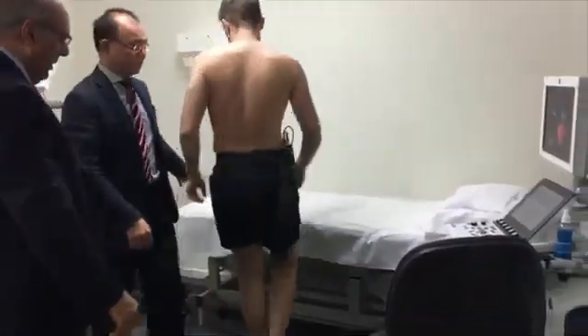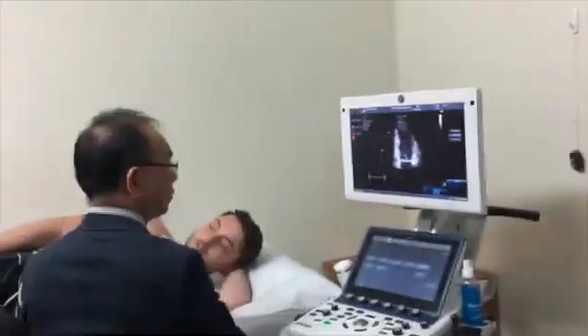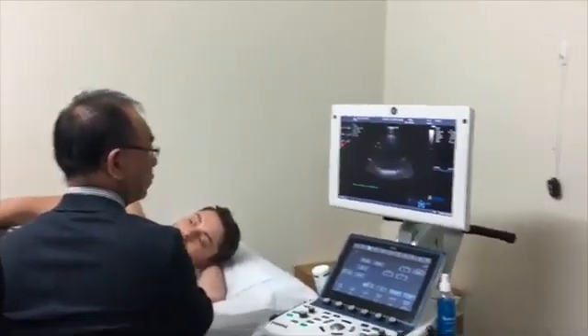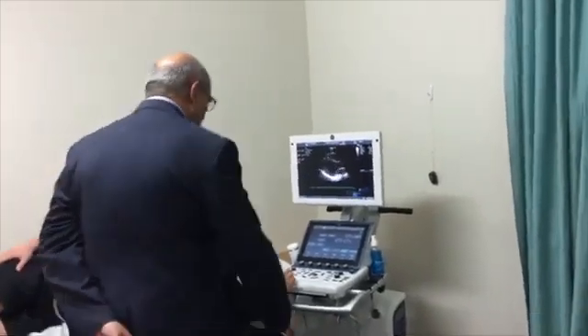When the treadmill comes to a complete standstill, you will be asked to come off the treadmill and lie down on the bed, taking the same position. The echo technician will be ready to scan your heart again to take stress images with the same ultrasound probe.